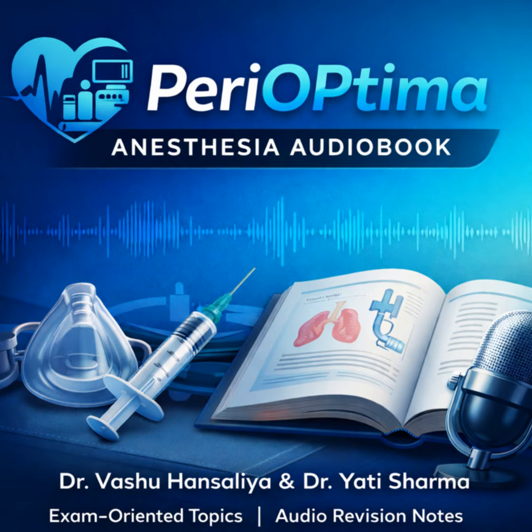And this is why depth is so critical with a Miller. Right, the trap warning. Exactly. Go too deep, and you're in the esophagus. Don't go deep enough, and the epiglottis just flops back down and blocks your view. The sweet spot is just past the edge of the epiglottis, near the anterior commissure of the cords.